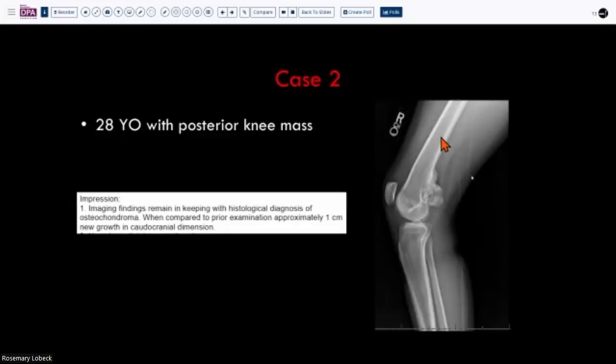So another case in the red category over here. This time we have a younger patient with a posterior knee mass. And you can see this little polypoid bony protrusion coming off the backside of the femur in this patient. And apparently a biopsy was done earlier. And the radiologist, on reviewing this X-ray, says the findings remain in keeping with the histological diagnosis of an osteochondroma, right? So this looks appropriate at this point.